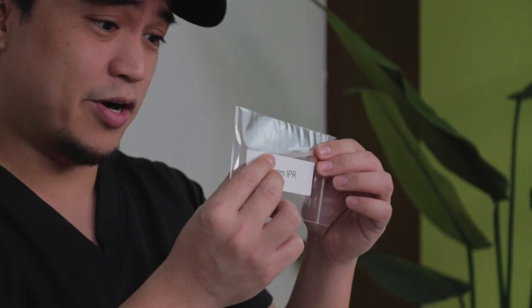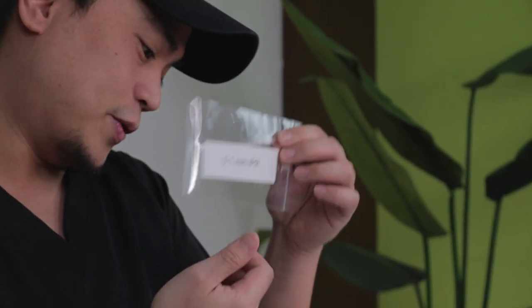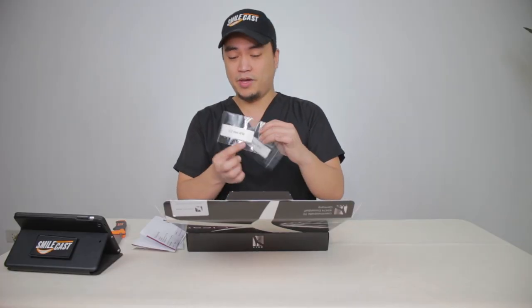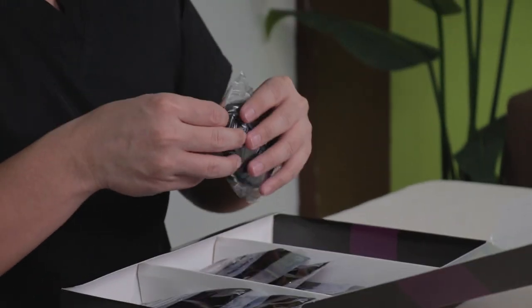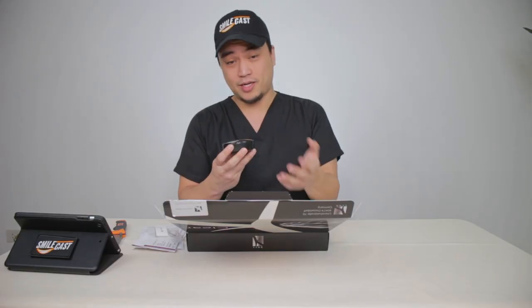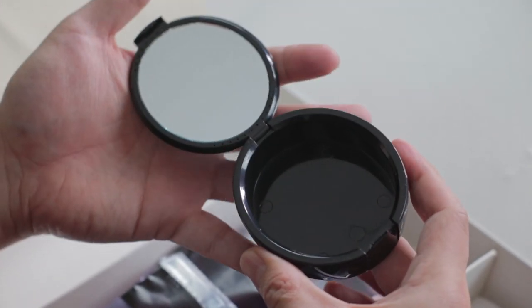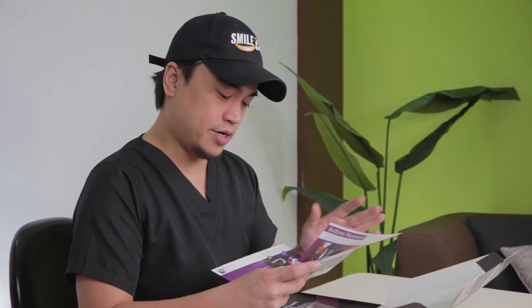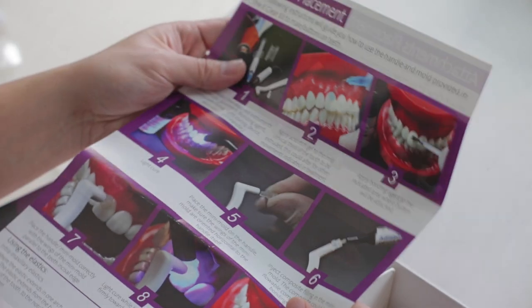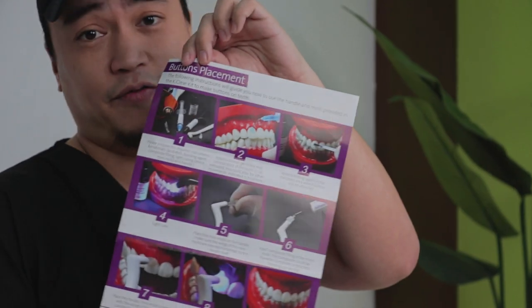We have the IPR strip — this one is 0.1 mm — and the IPR strip for 0.2 mm. We also have the aligner case. Here's the aligner case. We're going to open it and there's a little slot for your aligners and a mirror. We also have instructions for the attachment placement, showing you how to do that process on the patient, and button placement if needed.